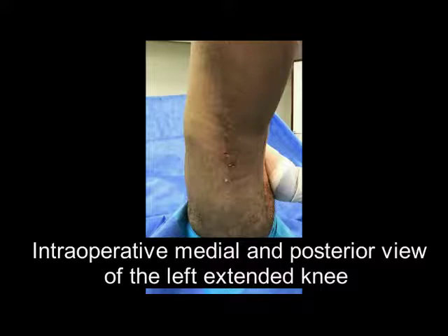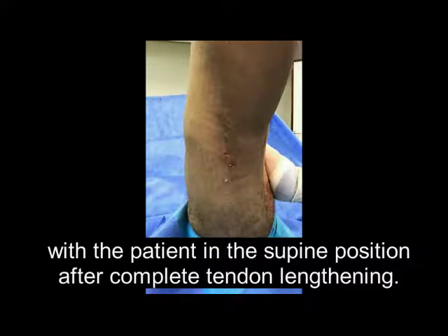Intraoperative medial and posterior view of the left extended knee with the patient in the supine position after complete tendon lengthening.